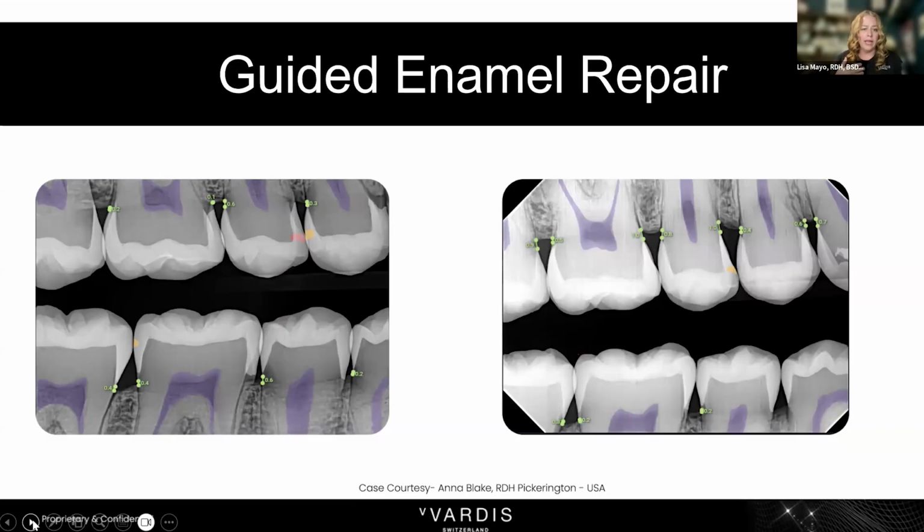Like Annie said to her testament, when I asked her what she has seen practices doing when you have these E1, E2, maybe even early D1 lesions where you're like, is it through the DEJ? Is it not? Kind of like Braden's 8 and 9. Was it through the DEJ? Was it not? Two-dimensional pictures of three-dimensional objects. Many times the decay is deeper by the time the doctor gets in there than what they saw on the x-ray, which is a pretty common occurrence.